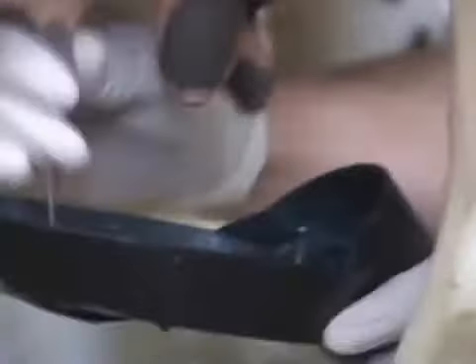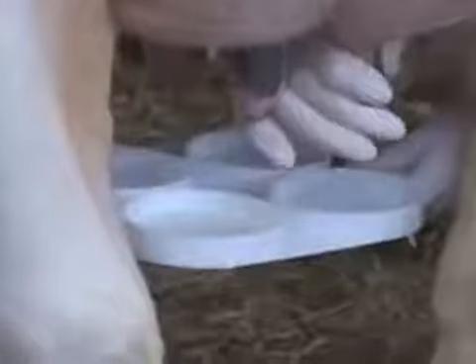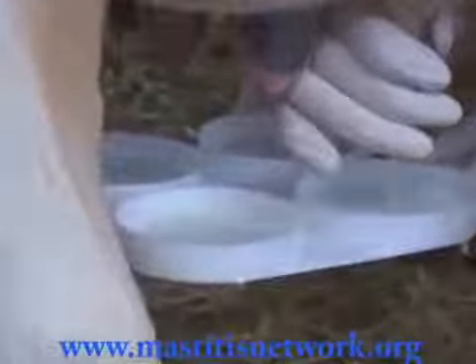The first step is to make sure the teats are clean and free from dirt. Then, strip in a strip cup and check for abnormal milk. In step 2, always use the same paddle position from cow to cow, always on the same side of the animal, right or left. This will make it much easier to keep track of quarters when interpreting results.